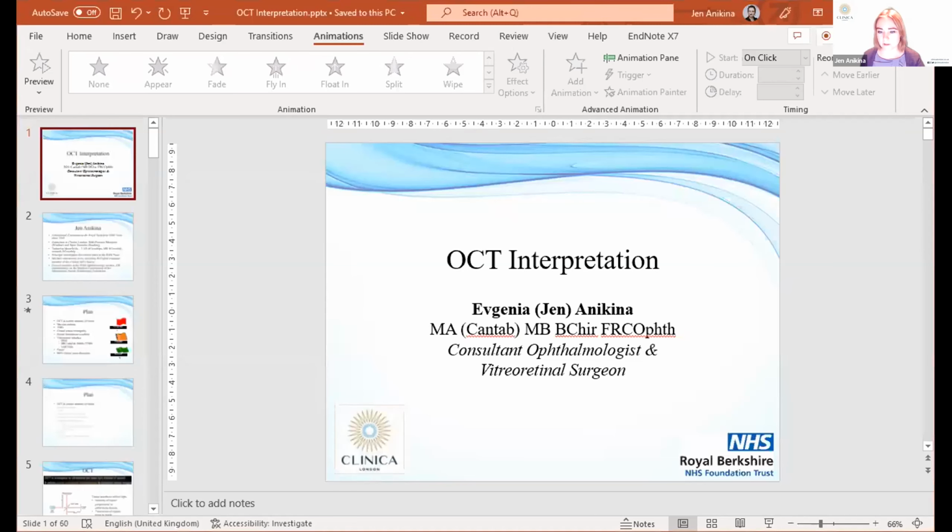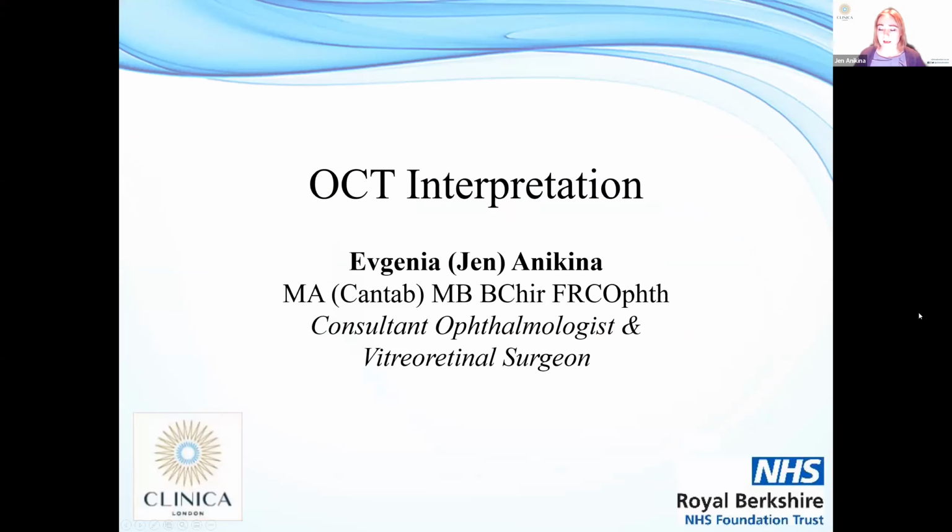Let's get started. Thank you very much, Jane, for that lovely introduction. I feel a bit oversold, but we'll get cracking. This webinar is here today by popular demand. At the last webinar we hosted, there were a lot of requests for an OCT interpretation session. So here we are, on request of the crowd. Without further ado, we're going to talk today about OCT interpretation and its clinical relevance.